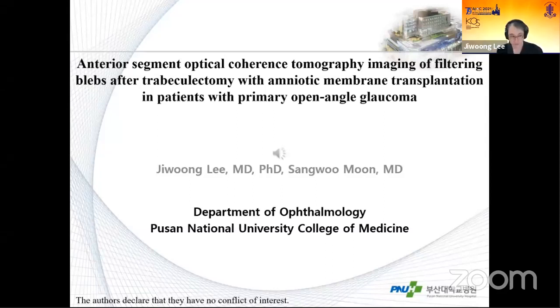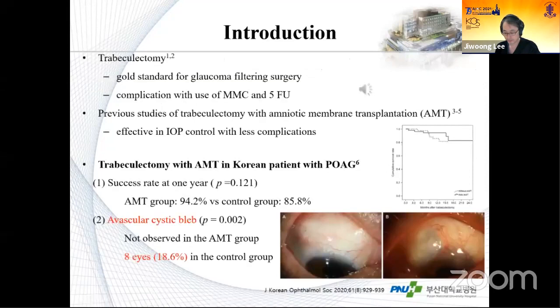Today, I would like to talk about anterior segment optical coherence tomography imaging of filtering blebs after trabeculectomy with amniotic membrane transplantation in patients with primary open-angle glaucoma. Trabeculectomy is still the gold standard for glaucoma filtering surgery. However, it has complications associated with mitomycin C and 5-FU.